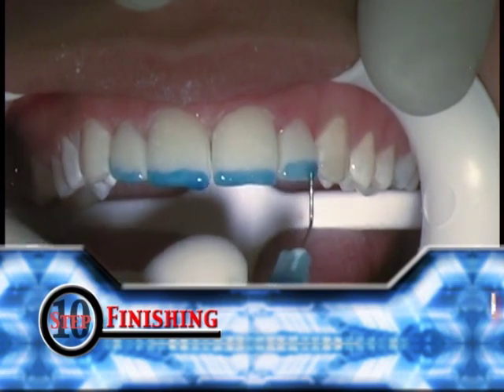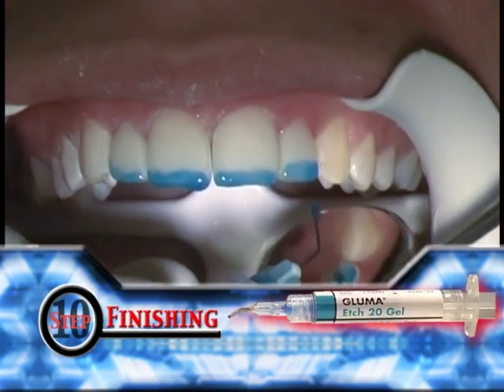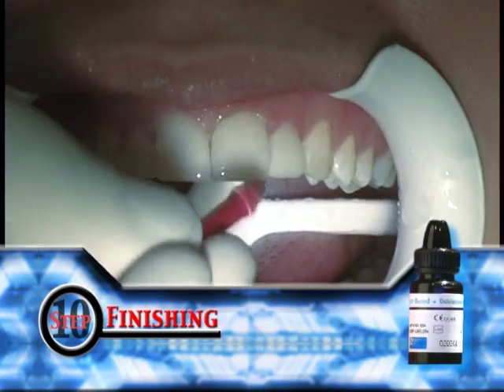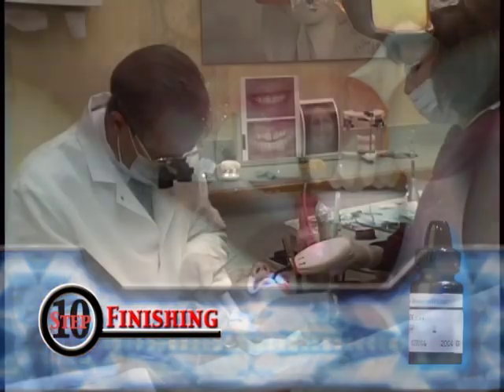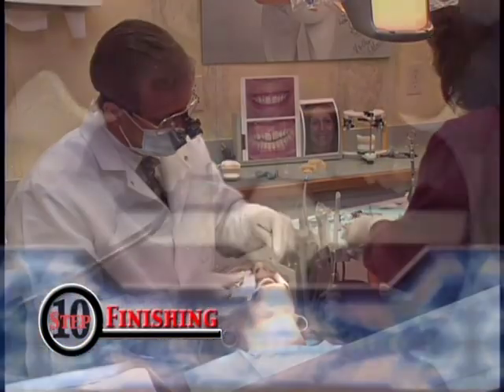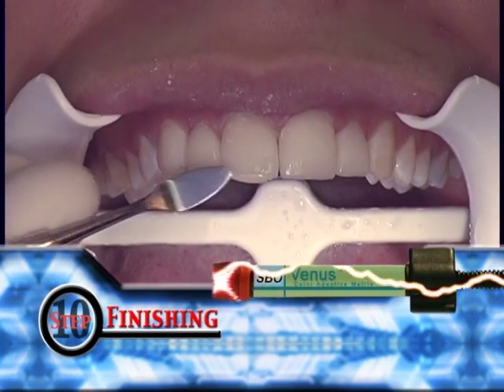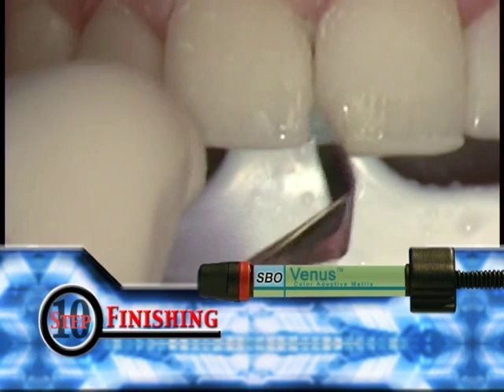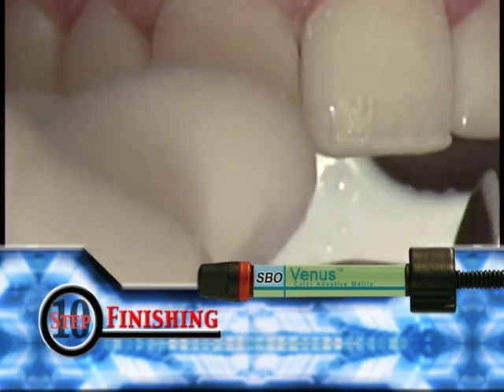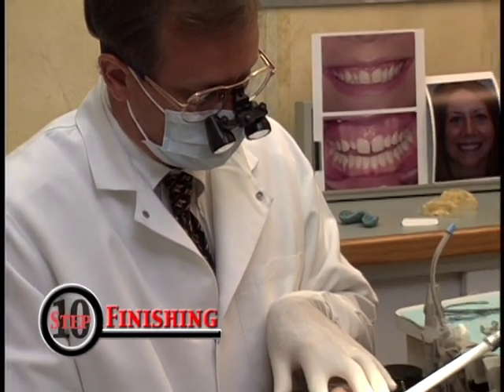Once all the teeth are finished, it's finally time to add the incisal halo. Etch the edge of the teeth to cleanse. Now apply Gluma Comfort Bond Plus Desensitizer, dry for a few seconds, and light cure as usual. Finish by applying a high-value white color such as Venus Shade SBO, which is super bleach opaque, to the edge and light cure. As we do not want to add length to the tooth, you may want to compensate while you are trimming and polishing prior to adding the halo.